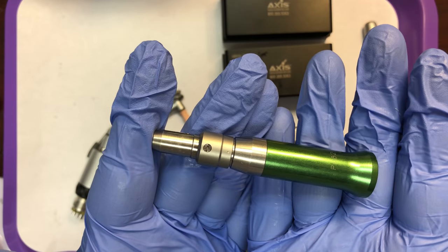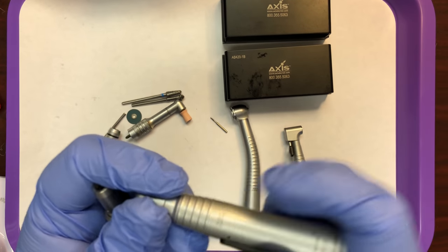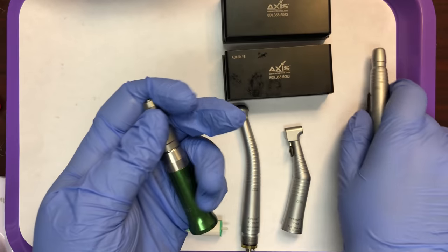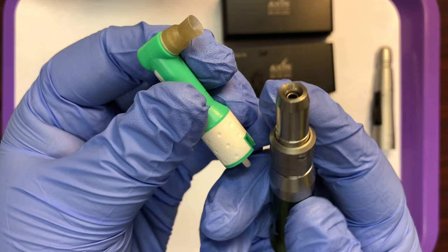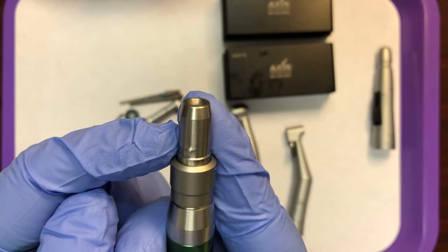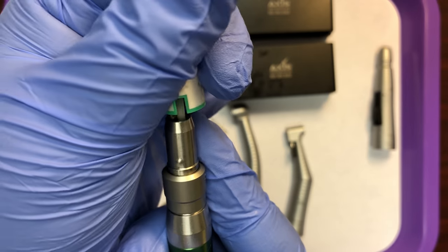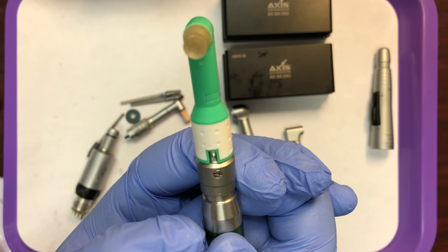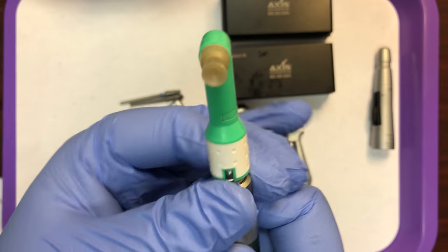The other thing that will fit into this handpiece attachment is a profi angle. This particular attachment will not be able to receive a profi angle just based on the design of it, but this one will. So when I have this open, I'm going to take my profi angle. Line up this little bump with your notch on your profi angle and then lock it into place. Give it a little tug to make sure it's secure. Unlock and then you can remove it.